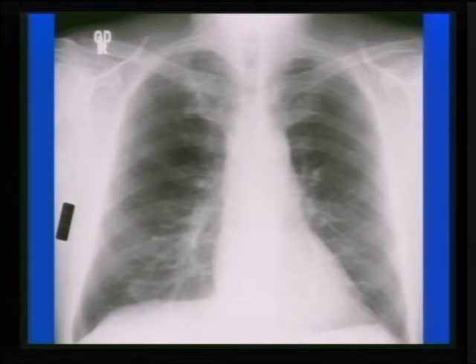This is an old study, and again, I want to go back to the importance of reading chest X-rays and looking at the hidden areas. The most common cause of missed lung cancer, and the most common region where cancer happens, is in the upper lungs. So do you see where the cancer is? There's a 2.5 centimeter cancer here.